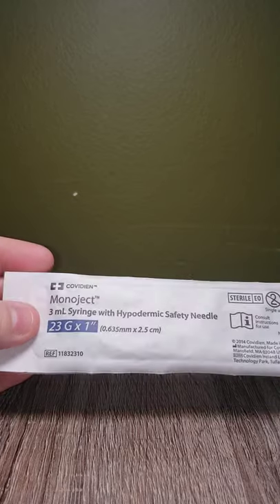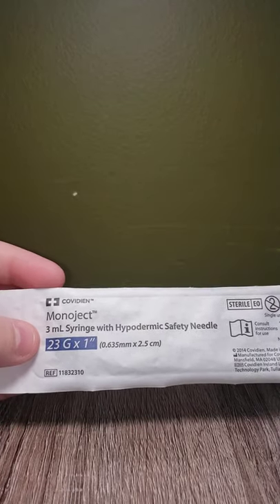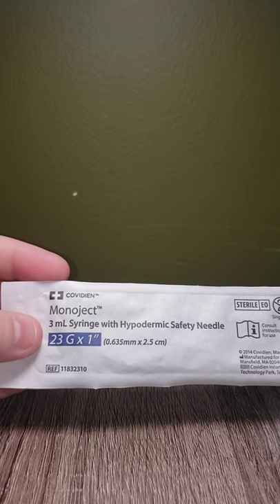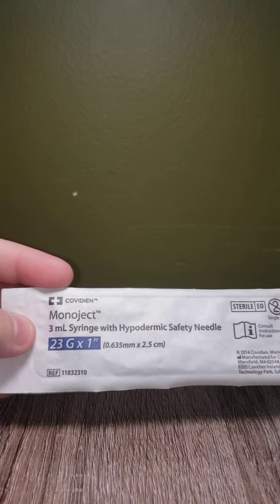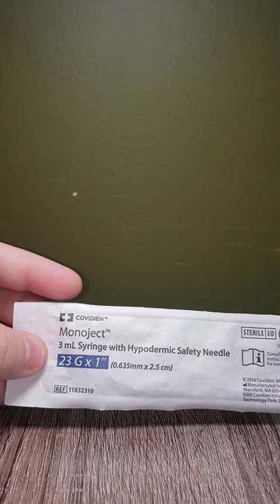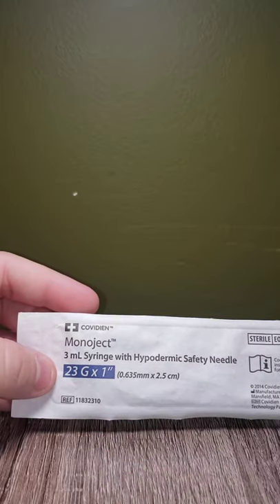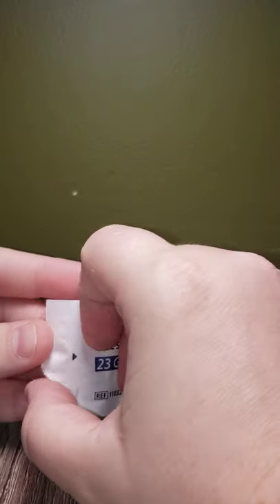So in my hand, I'm just going to simply read the label, but when you further yourself in your studies and your practice, you'll learn colors immediately and what they are. So: 3ml syringe, hypodermic safety needle, 23 gauge, and it's a one inch needle. Alright, so let's open her up and get started.